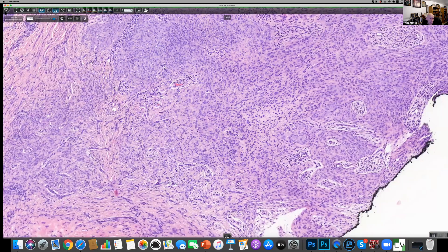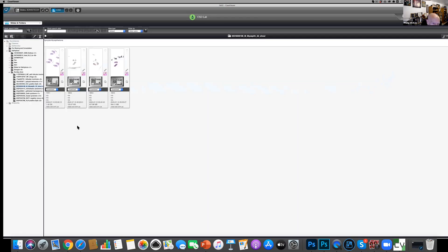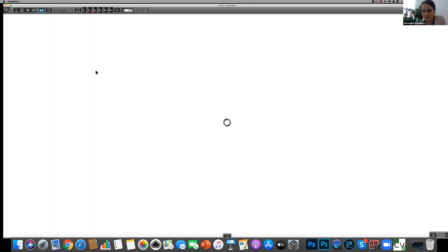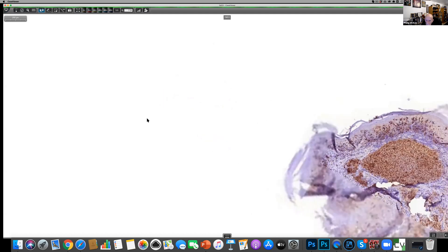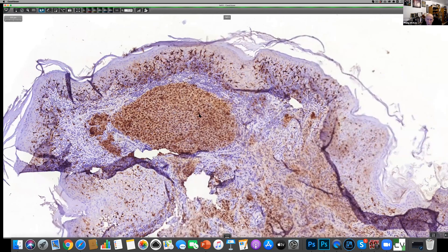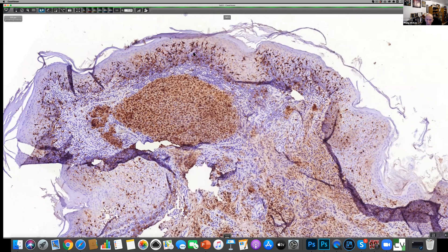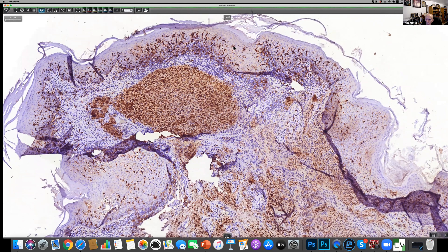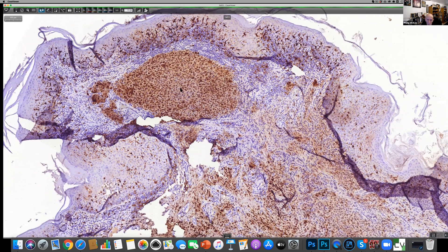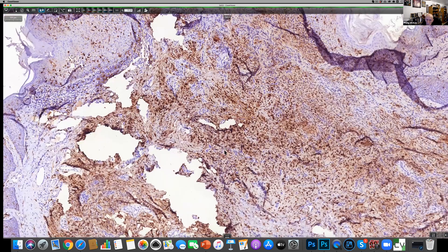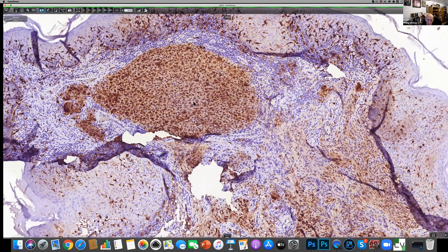Looking at some immunohistochemistry — this one is S-100. Now look at that. We can tell it's S-100 because we've got all these Langerhans cells up here, in a state of frenzied activity. And there are the tumor islands, beautifully positive for S-100 protein. That's absolutely gorgeous.